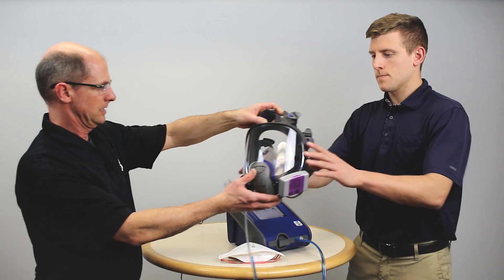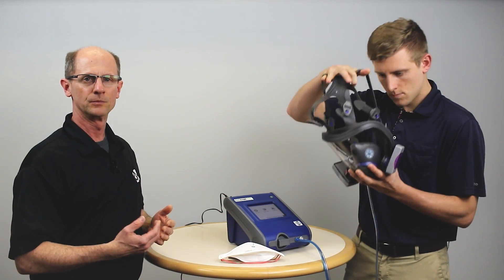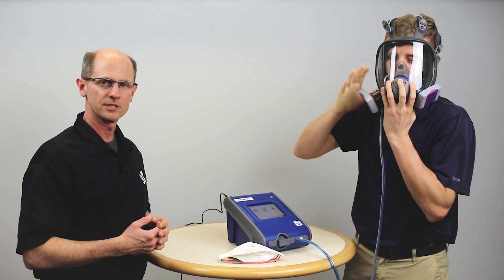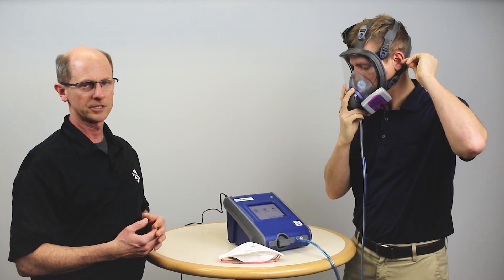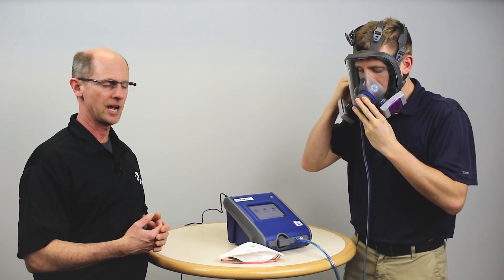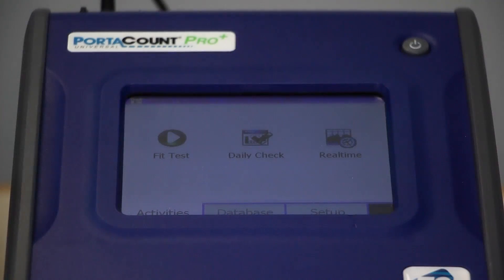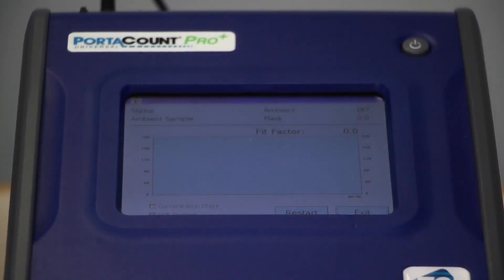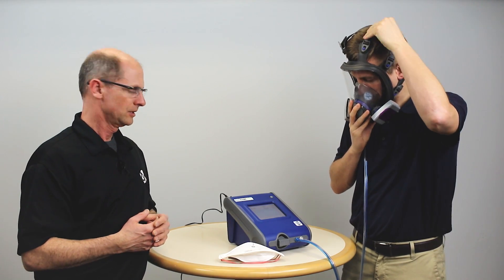I'll put this on and demonstrate how real-time mode can help learn how to adjust the respirator. I'm using a PortaCount in standalone mode — I've already completed the daily check. I've connected the clear sample tube to the fit test adapter and the other end of the twin tube to the respirator. From the activity screen, I simply hit real-time and it starts into real-time mode.